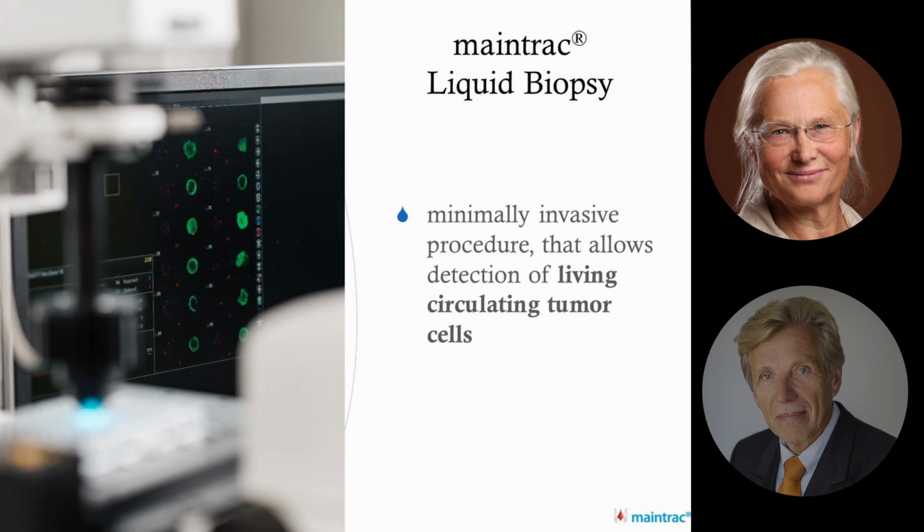So we would subsume our method among the liquid biopsies, which means a minimally invasive procedure that allows detection, in our case of living circulating tumor cells, living cells that are detected in peripheral blood.